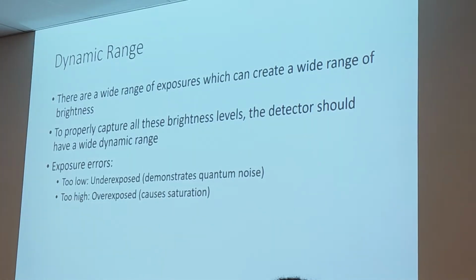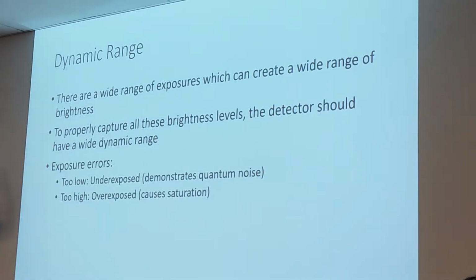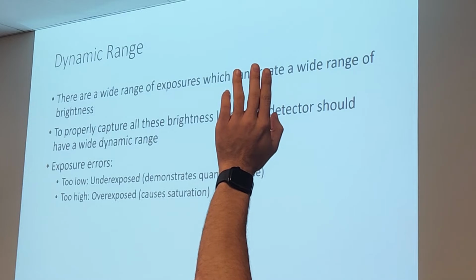So now we don't really have these exposure errors. You would need to do something very, very bad to end up with these exposure errors. What do I mean by really, really bad? For example, who's done portables? Anyone have to do a portable knee? Okay, a few of you.